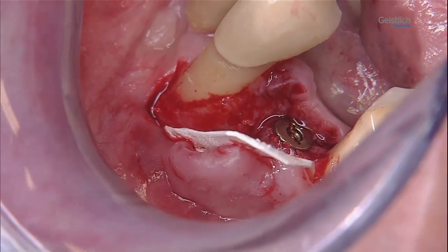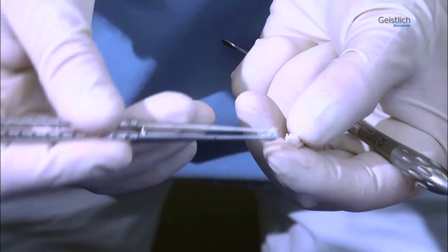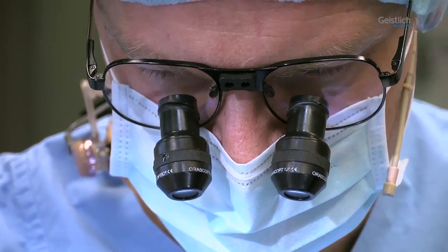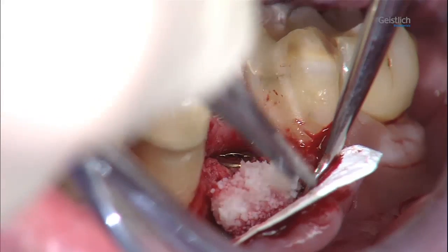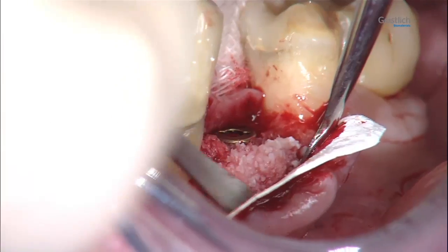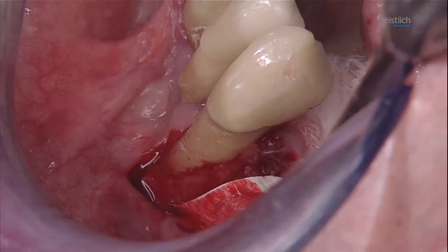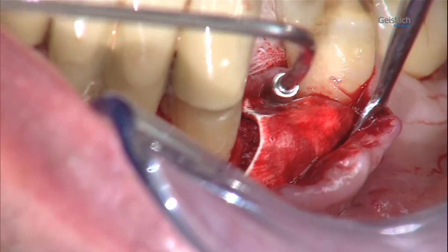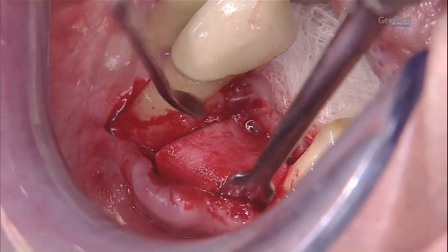The Geistlich Bio-Oss Collagen block consists of 90% Geistlich Bio-Oss granules. The remaining 10% is collagen, which holds the Geistlich Bio-Oss granules in the block together. This collagen has no barrier function. The barrier function is provided by the Geistlich Bio-Guide membrane. The block absorbs liquids very well and is easily divisible and moldable. These properties make the introduction of the bone substitute material into the defect considerably easy. Here we have created a small disc shape which, after its introduction into the defect region, may be further shaped and pressed into place with a suitable instrument, such as a bone rasp.